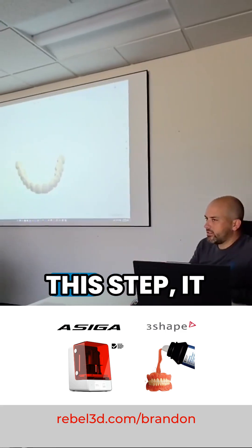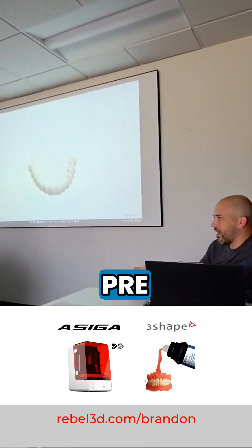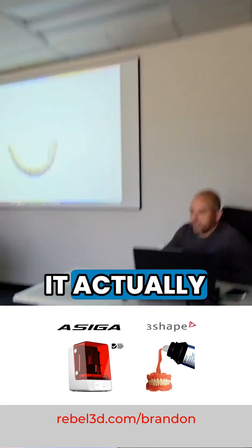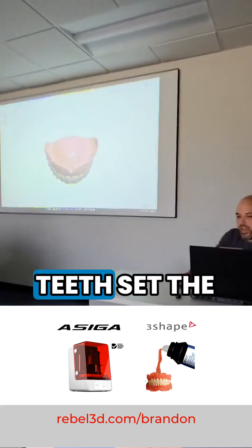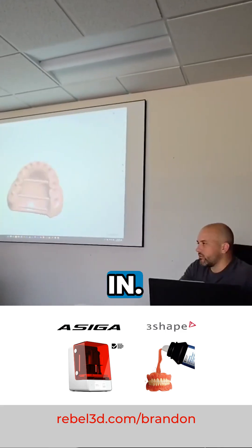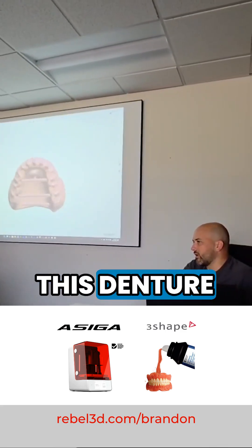Now when I go out of this step, it takes me into pre-manufacturing. What the pre-manufacturing step does is, now that we've got our teeth set the way they're supposed to be, we have to cut our pockets in. You can see there's no pockets in this denture base.